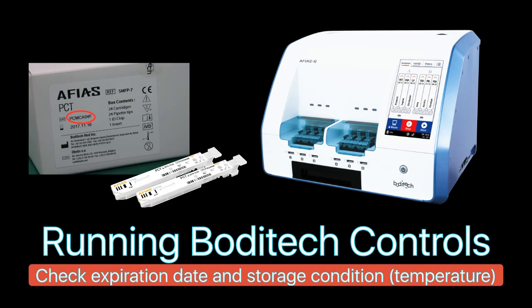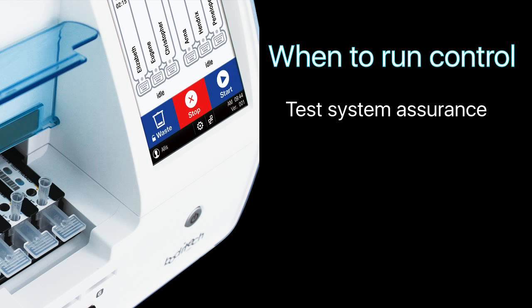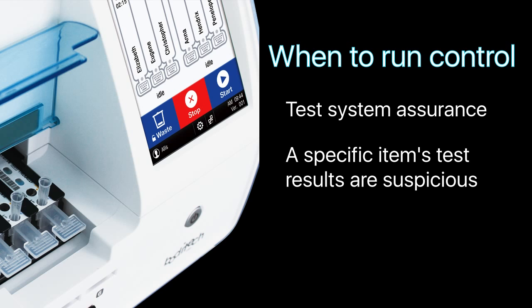In this demo, we will run Boditech PCT control in AFIAS PCT with lot number PCMCA04F. We recommend running the control regularly for test system assurance, when a specific item's test results are highly suspicious and far different from the expected result value.